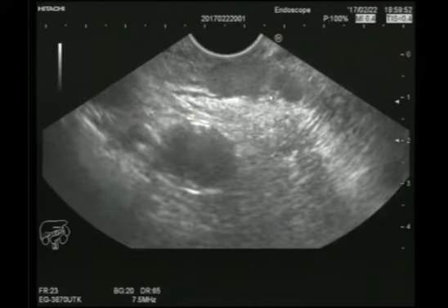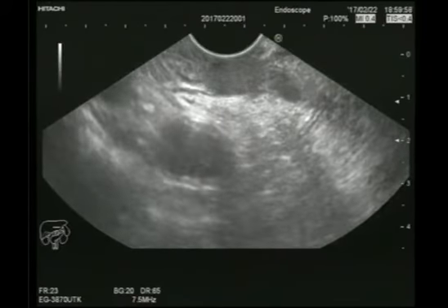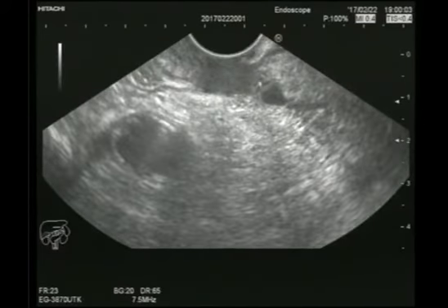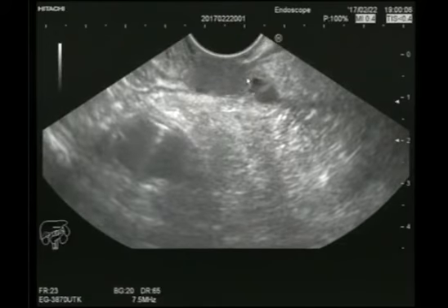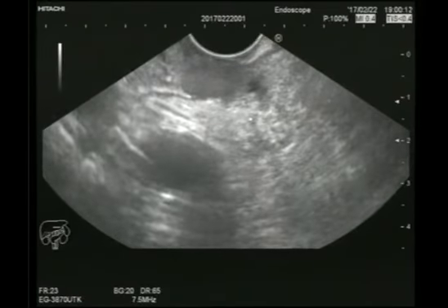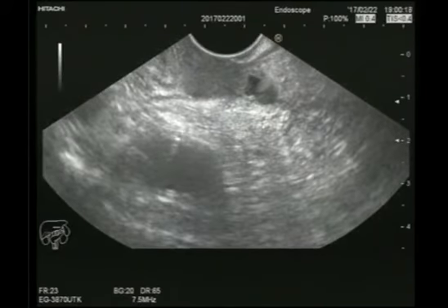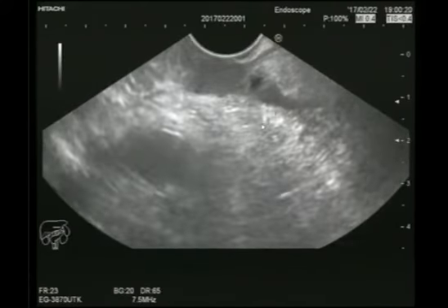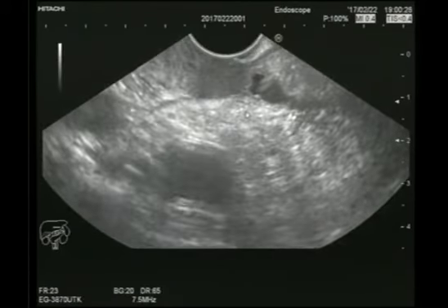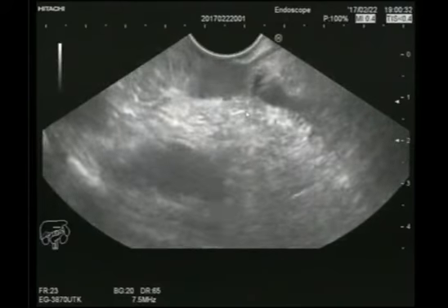Okay. Here the muscularis. Now, for the sake of time, we should be a bit quick. In 2 minutes, I am going to finish this case. What we see here is that this tumor is invading the pancreatic duct, and it is invading less than 2 centimeters. So finally, what we achieve is that this is a stage 3 papillary tumor. Then it deserves a Whipple procedure, pancreatic head resection, pancreaticoduodenectomy. So you see that for papillary tumors, endosonographic examination is very rewarding.